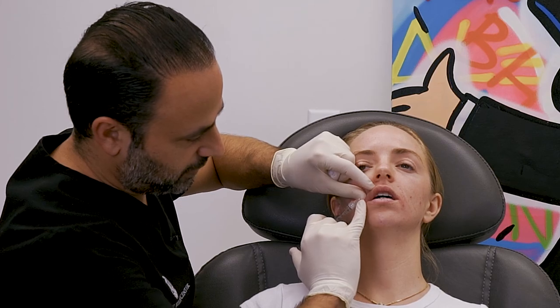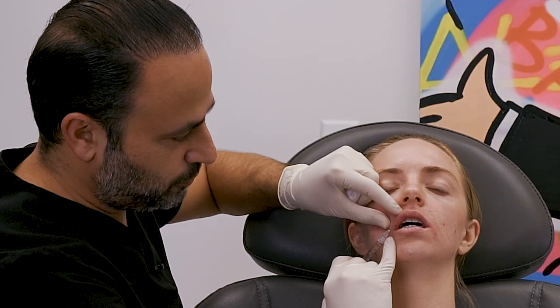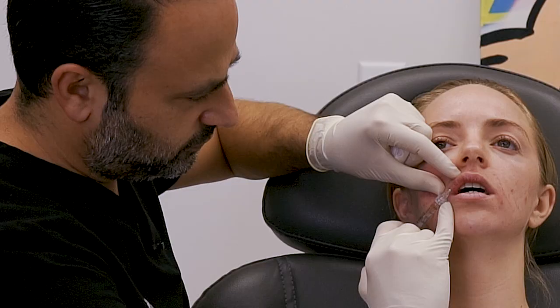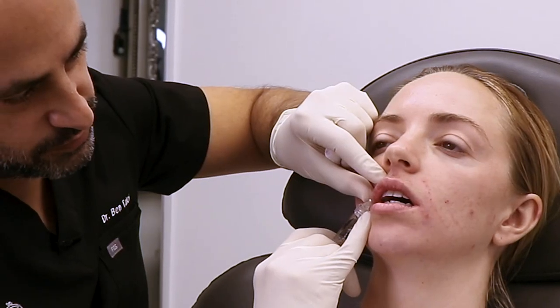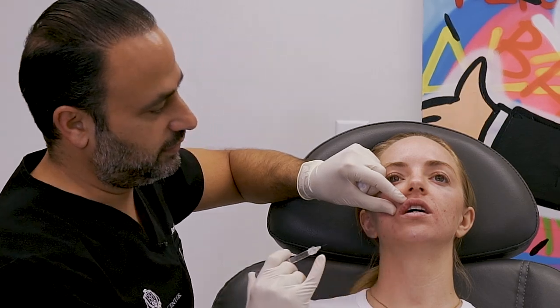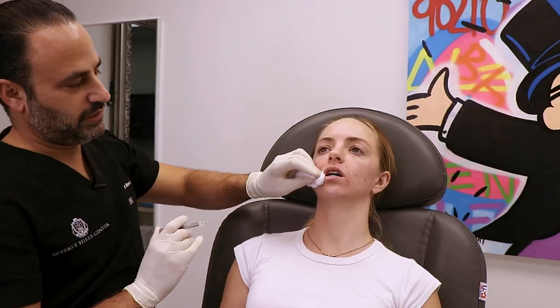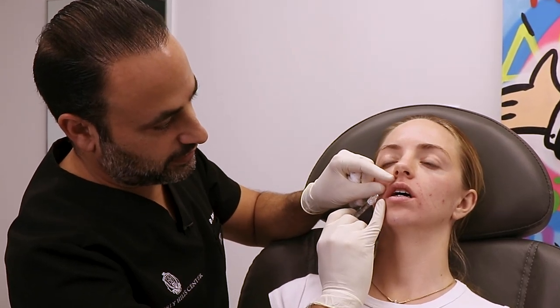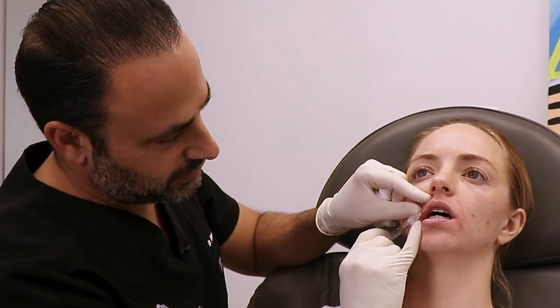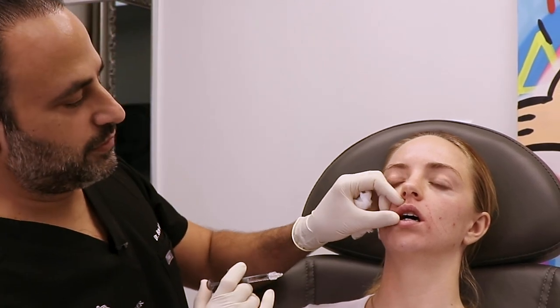I put my hand there, give pressure outwards, give counter tension, and go directly into the submucosa. If you go deeper than that, there are vessels. If you want to be super precise you can put your needle forward and do a retrograde. I do a little antegrade, push my way in little by little, and you have to watch what direction the filler is migrating — it does not always go straight forward, it goes wherever it wants. March myself forward again, push it out, pull towards yourself, get right into the mid vermilion body. Hyaluronic acid pulls water weight into the lip even if it's pre-hydrated, so it'll make her lip look more volumized.